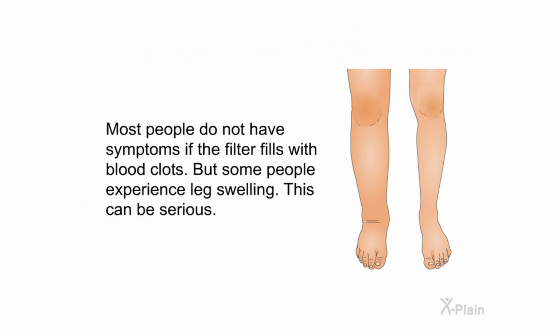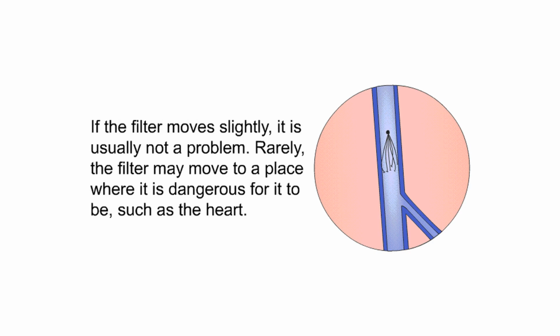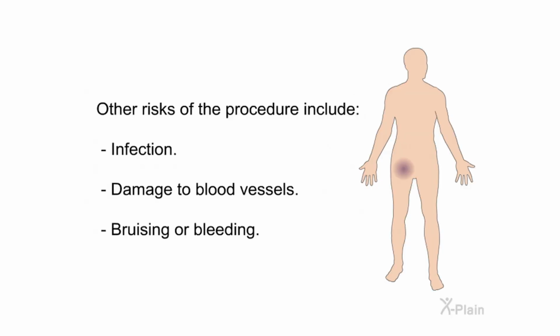Most people do not have symptoms if the filter fills with blood clots, but some people experience leg swelling. This can be serious. If the filter moves slightly, it is usually not a problem. Rarely the filter may move to a place where it is dangerous for it to be, such as the heart. Other risks of the procedure include infection, damage to blood vessels, bruising or bleeding.